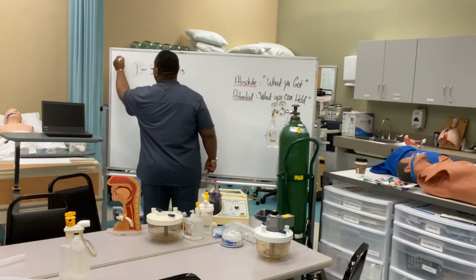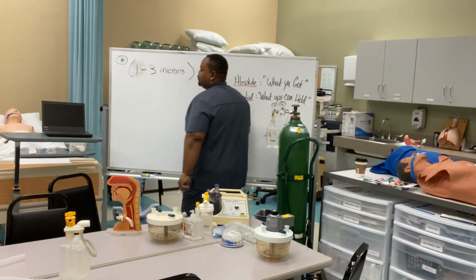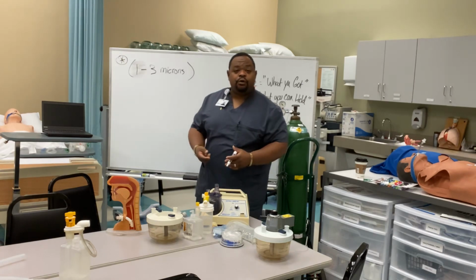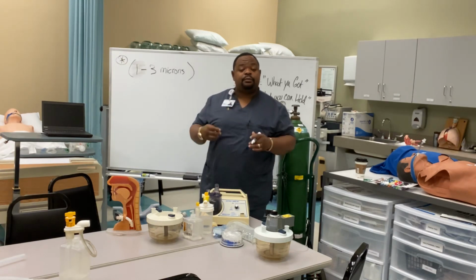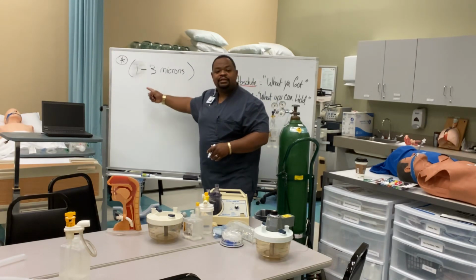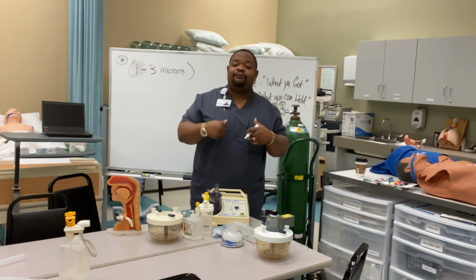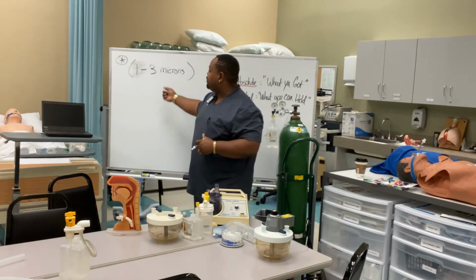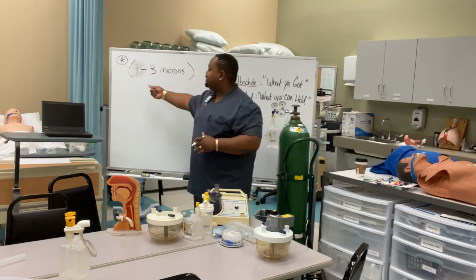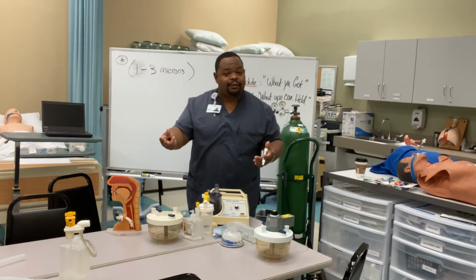Right? That is the ideal particle size. You want the particles in your medicine nebulizer to be 1 to 3 microns. That will ensure deposition of the drug or the particle in the alveoli. If they're greater than 3, they may deposit early, right? If they're less than 0.5, then they will come in and come right back out.